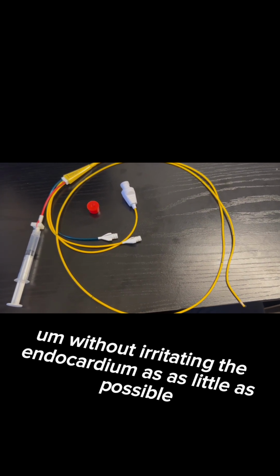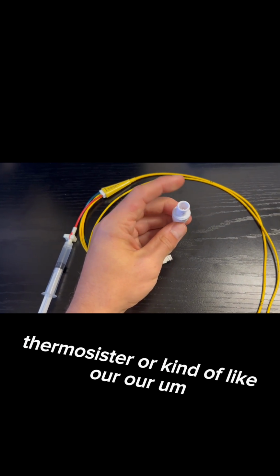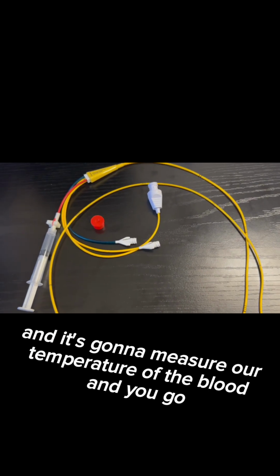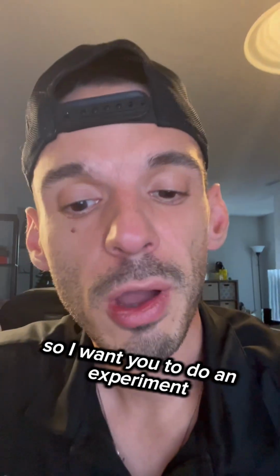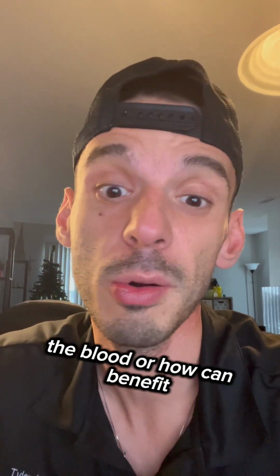And then we go over to our thermistor, or kind of like our thermometer, that is what's going to plug in, and it's going to measure the temperature of the blood. And you go, well, why the heck would we need to do that? So I want you to do an experiment. This is going to help you maybe visualize why we need to measure the temperature of the blood or how it can benefit.